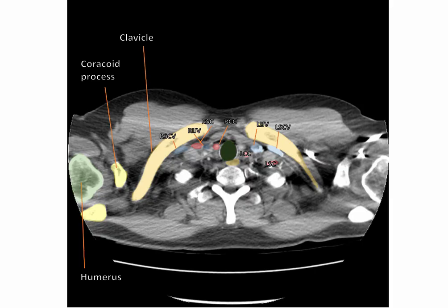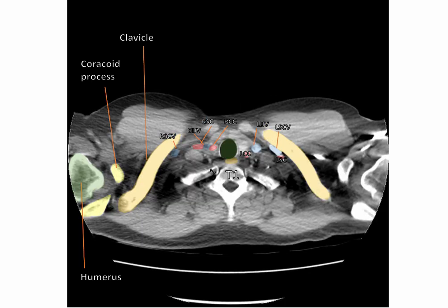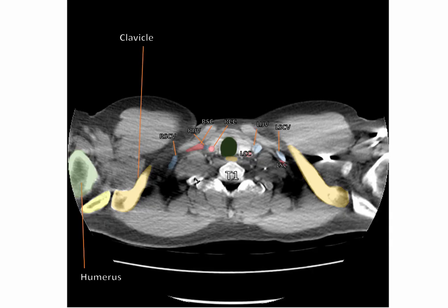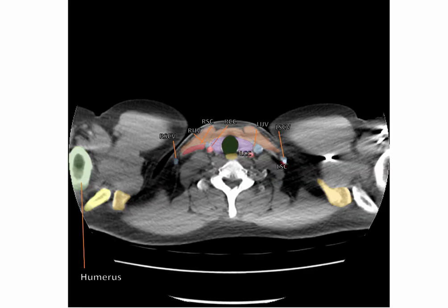We can also see the associated pectoralis minor muscle, and external to that, the pectoralis major muscle. As we proceed upwards, we can see the acromial end of the clavicle articulating with the acromion of the scapula here at the acromioclavicular joint. Also at this level, we can see the sternocleidomastoid muscles and the deeper strap muscles of the neck. We can also see the thyroid gland, which is anterior to the trachea, in purple. We have now reached just above the level of the superior thoracic aperture, also known as the thoracic inlet, sometimes known clinically as the thoracic outlet.